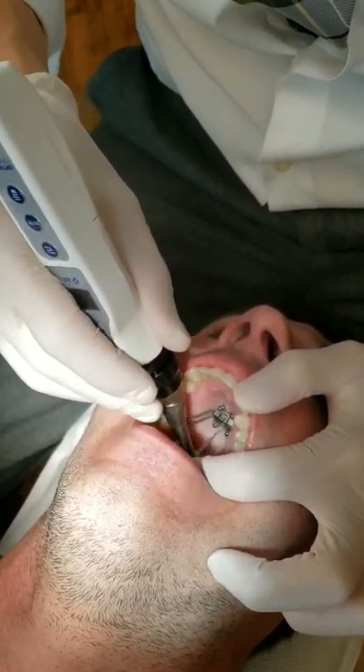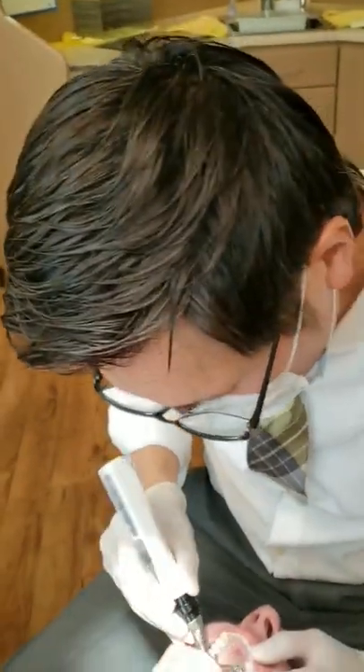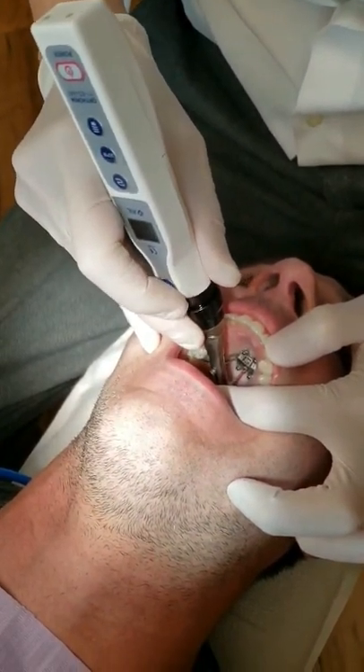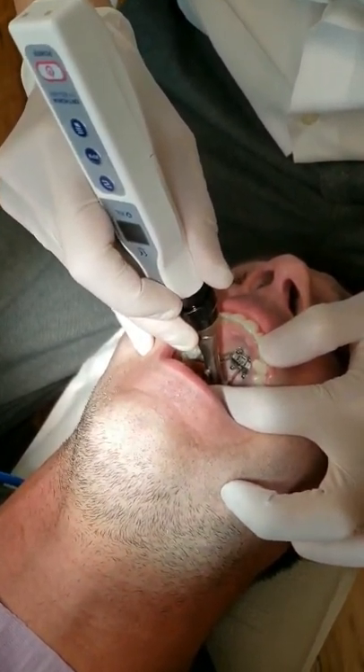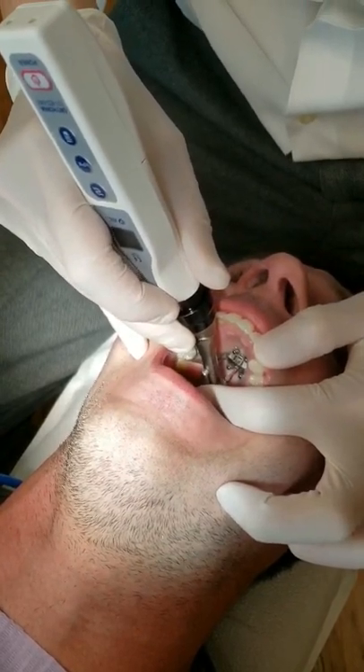I went in. I don't even do the reverse turn — you don't have to. So I went in. His suture doesn't feel that tight, which is a great thing. I do it from behind and also in the front.